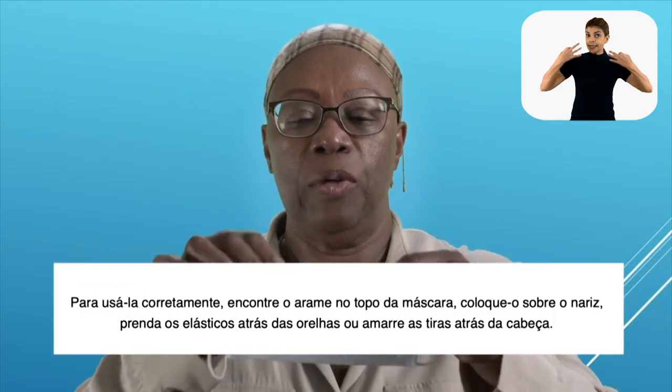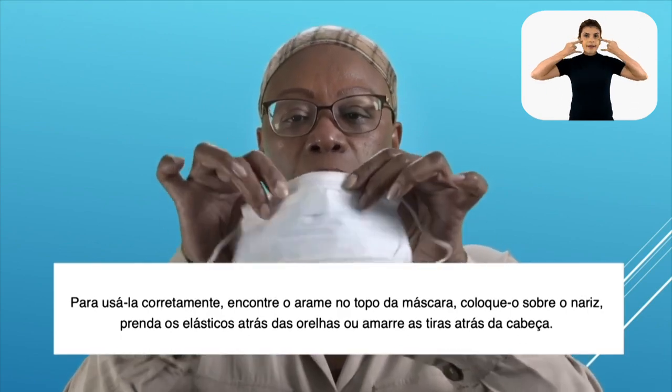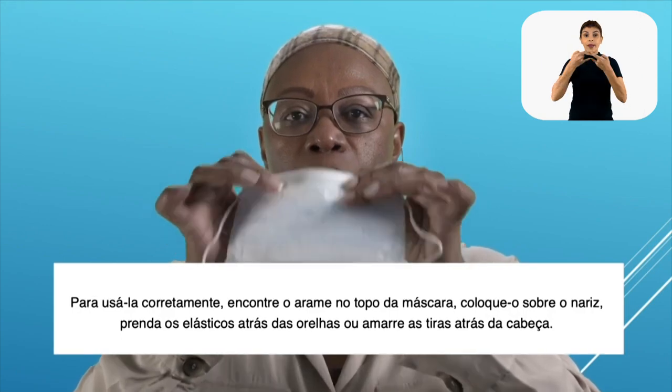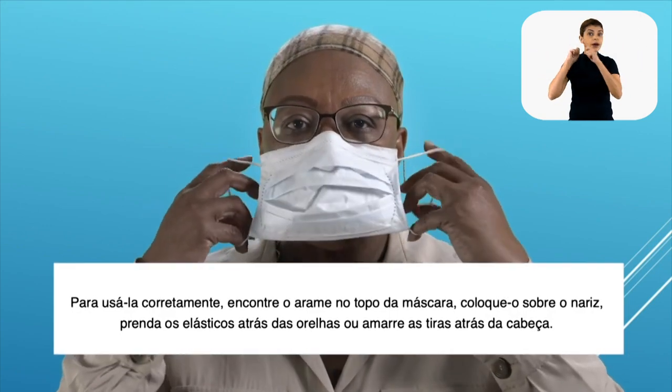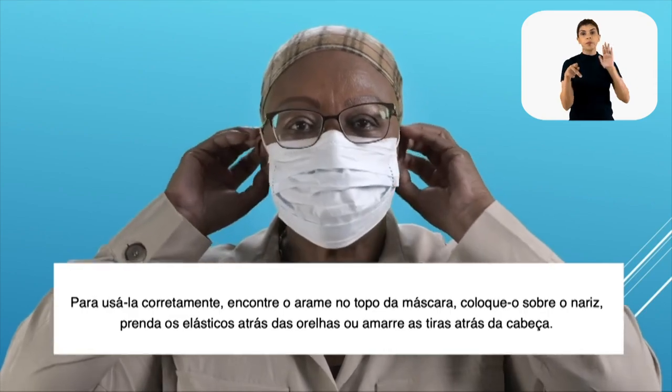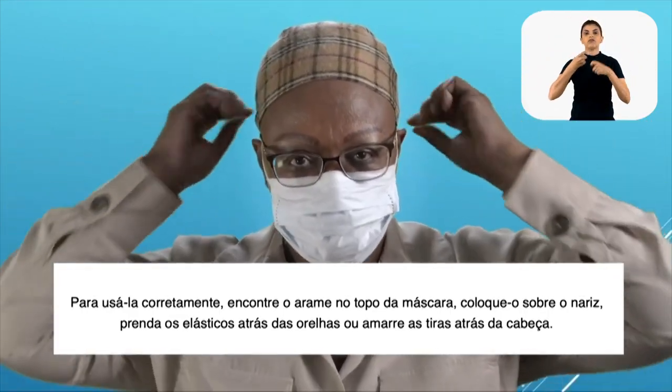To wear it correctly, you should locate the metal strip at the top of the mask, place it over your nose bridge, and secure the elastic around your ears or tie the strings behind your head.